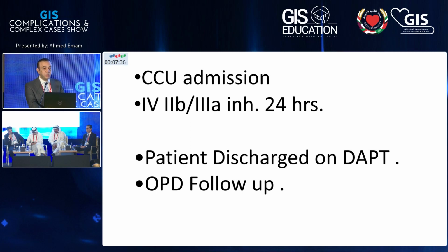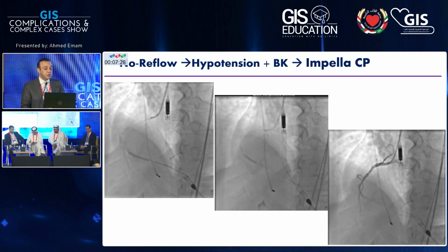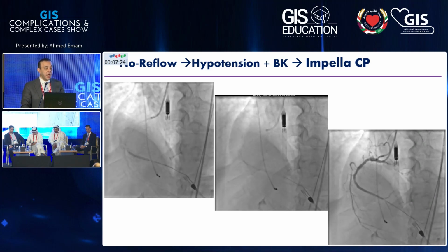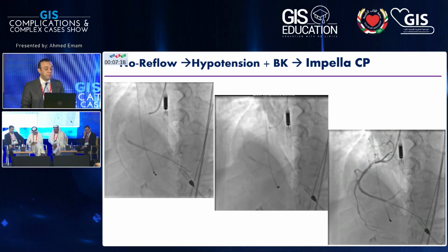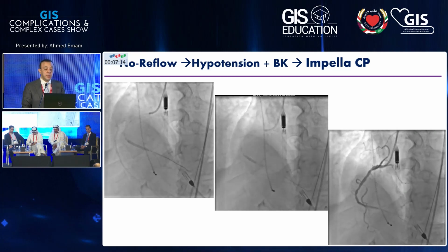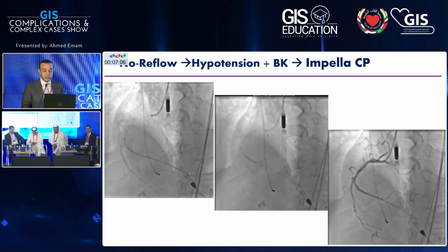One more thing, just to remind myself and you: no reflow is not usually a benign phenomenon. This is a different patient who developed no reflow. He had hypotension and bradycardia, necessitating a temporary pacemaker and Impella. So no reflow can lead to disasters and more complications.